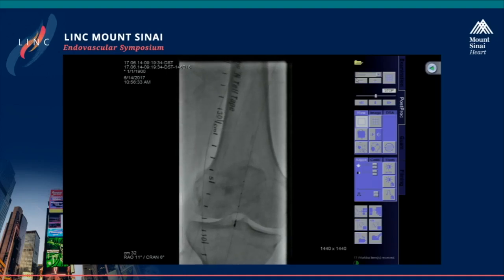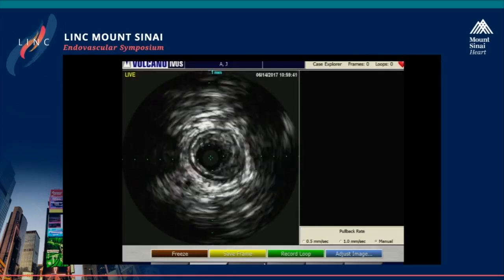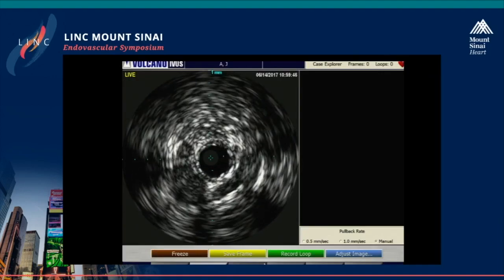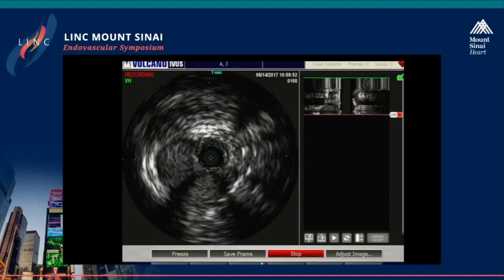Okay. Yeah. So now, obviously, we dragged the 035 catheter down, so we're just going to do a quick IVUS. Go all the way to the AT, please. Okay. And you're going to see probably a lot more soft plaque than you thought. So all the way down? Okay, good. Let's pull back here. So this is intravascular ultrasound. All of you are well-versed. You can see the veins next to the arteries and all the collaterals because of the chronic occlusion.